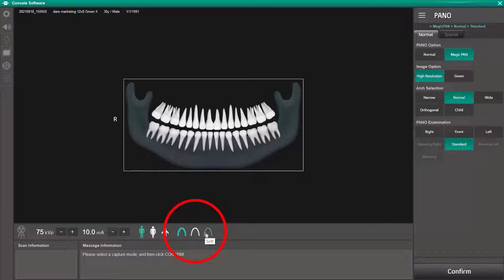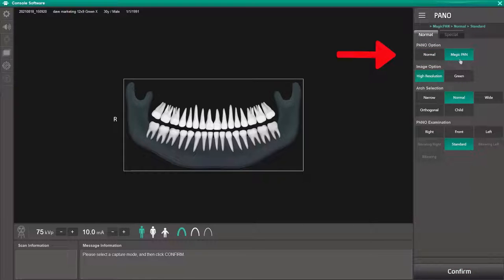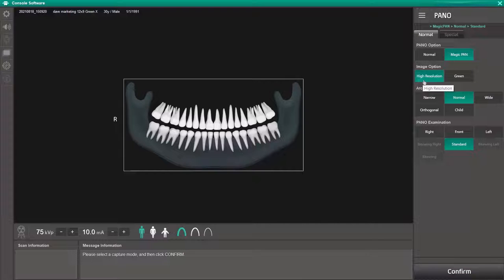On the right side of the screen under the normal panel options, the normal setting provides a standard panoramic image. Magic Pan provides a single optimal panoramic image having multiple focal images combined. Under image options below that are high resolution for best quality and the green setting for reduced radiation.